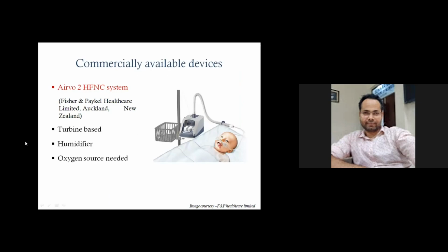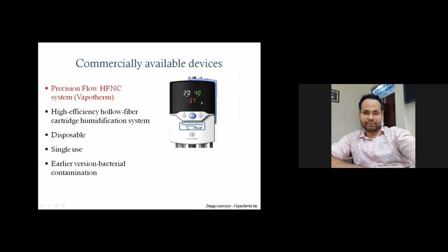Various commercially available devices are there in the market. Most commonly used in our NICU is the Airvo 2 HFNC system. It is from a company in New Zealand. It's turbine based and has a humidifier, and an oxygen source is needed.